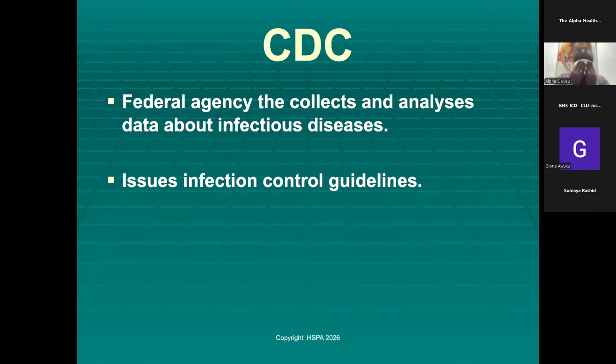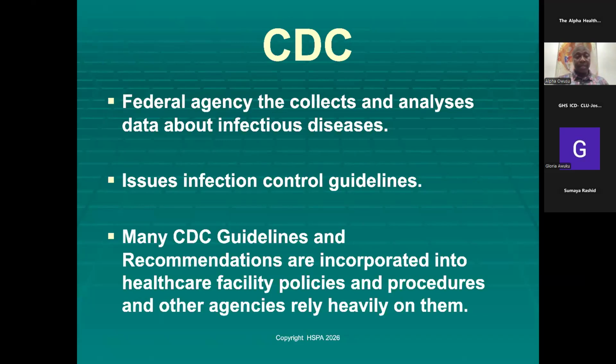That is what they do, right? Many CDC guidelines and recommendations are incorporated into health facilities' policies and procedures. And so you will see CDC in the guidelines for sterile processing; you see part of it in there.